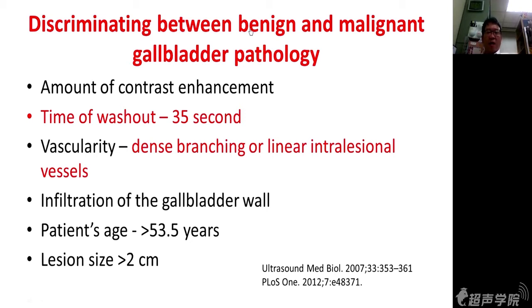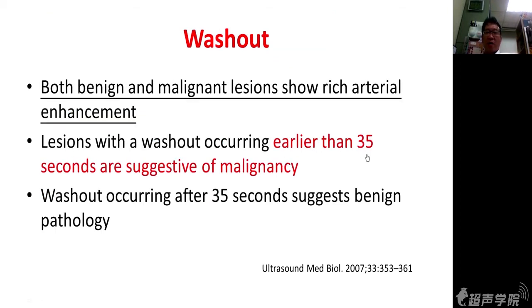And as I mentioned, the washout time of the contrast is very important. They found washout occurring earlier than 35 seconds suggests malignancy, and after 35 seconds suggests a benign gallbladder pathology.